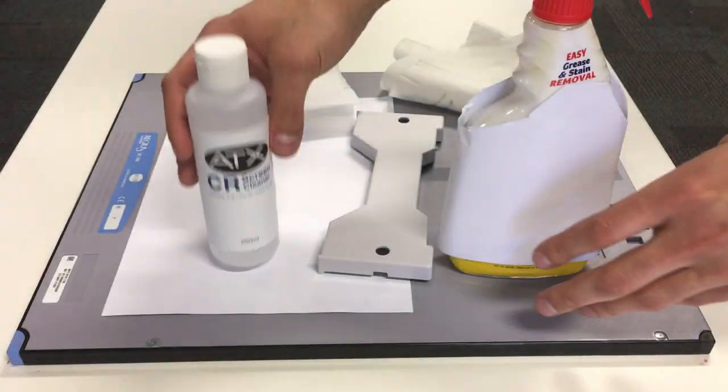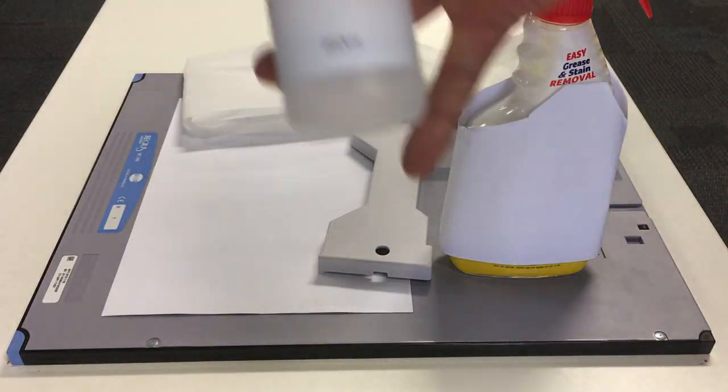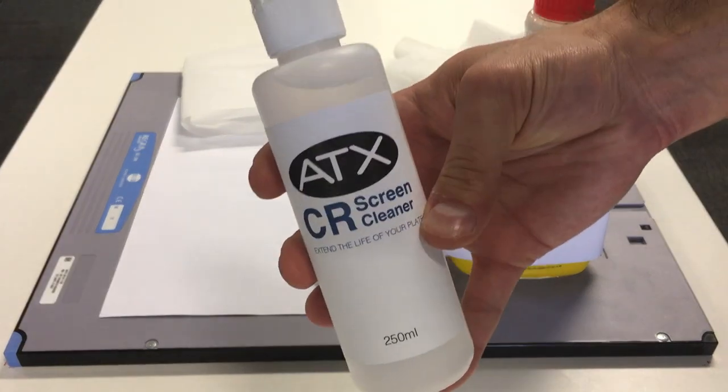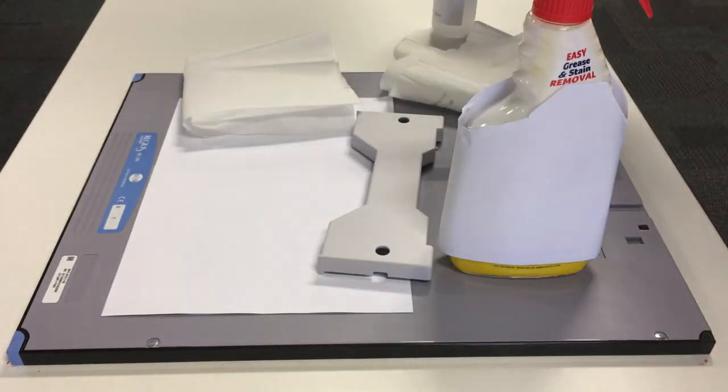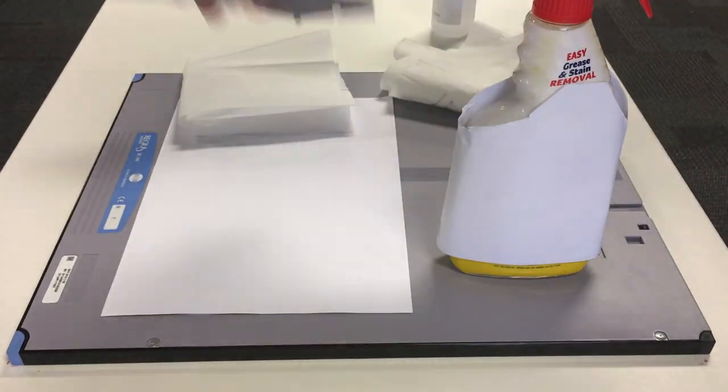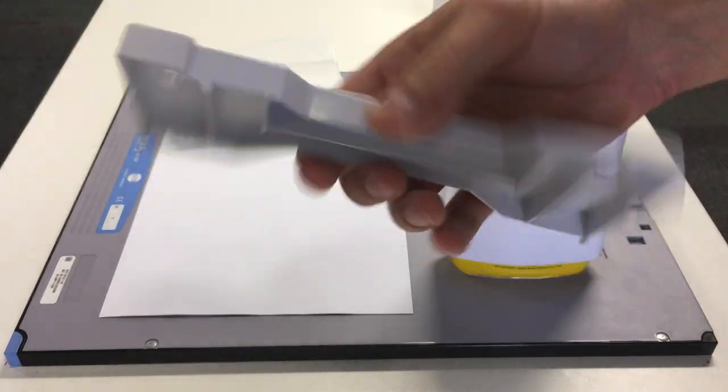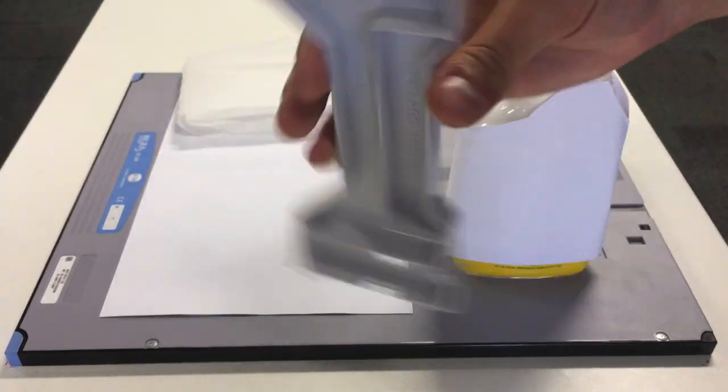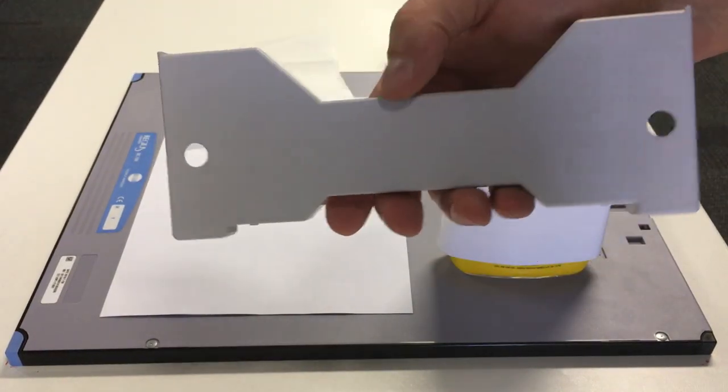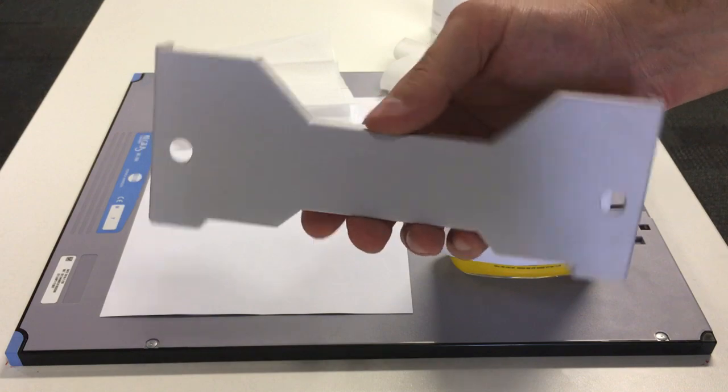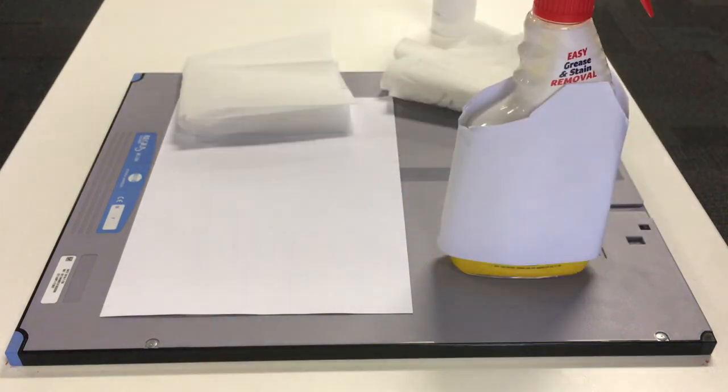So first of all, we have the AIX CR cleaner and we have the cassette tool opener from Konica. This is the tool that should have come with when you purchase the system.